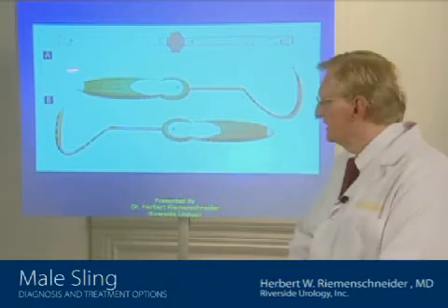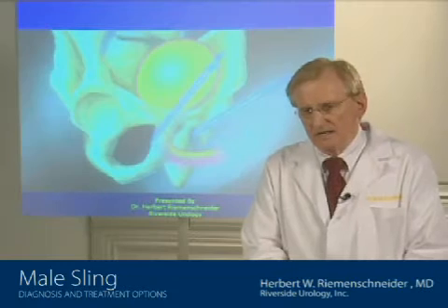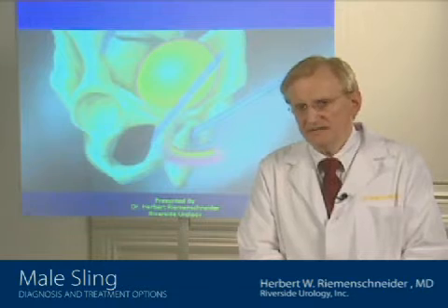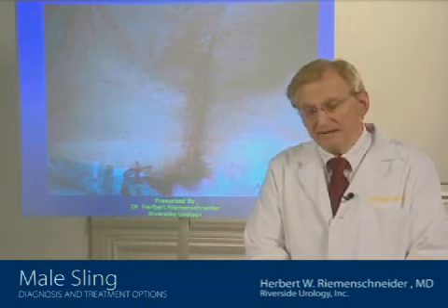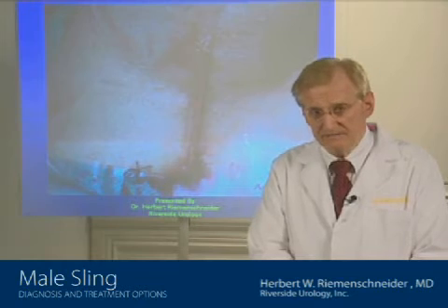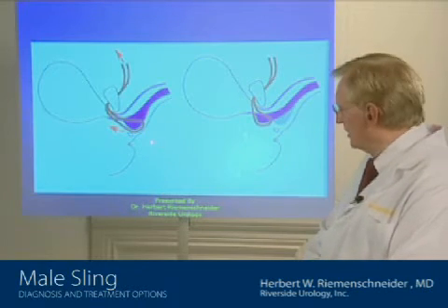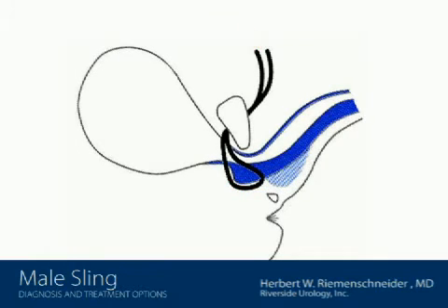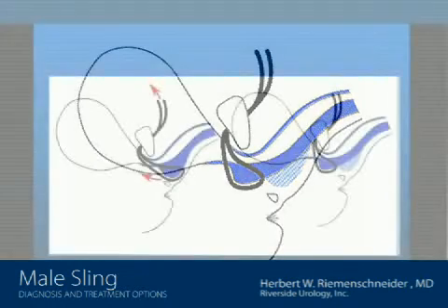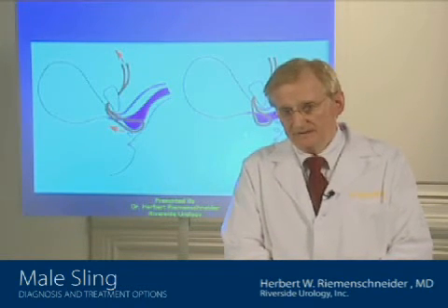Now, let's look at this carefully. This is the sling. It's a simple device made out of a particular type of thread or cloth. This whole event takes less than a half hour of surgical time. The incision is closed, and the patients go home that day, shortly after surgery. So essentially, here's our sling. This cloth, which we call a sling, is placed around the urethra, and then when it is snugged into the muscles through which it passes, it supports the urethra, and the net result of all of this is continence, dry pants.